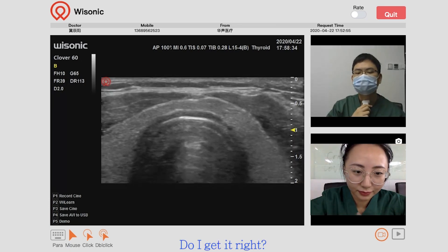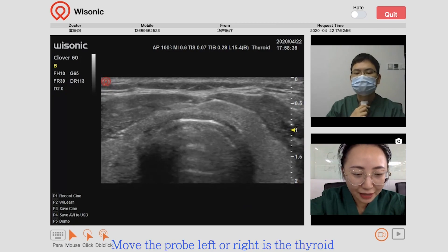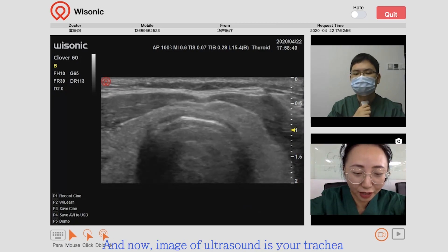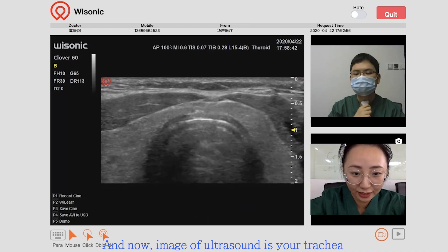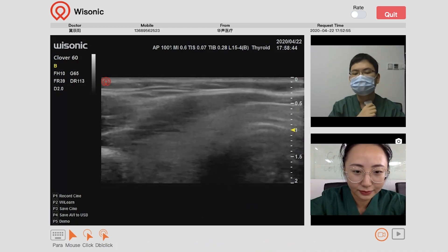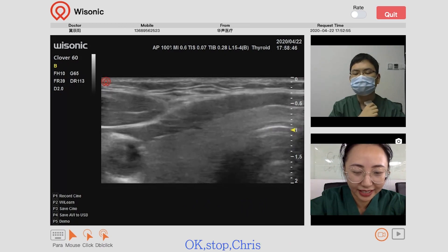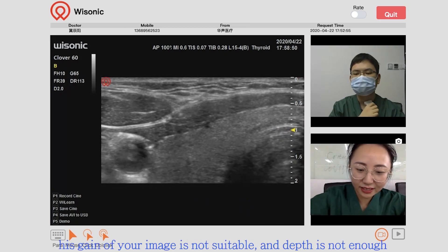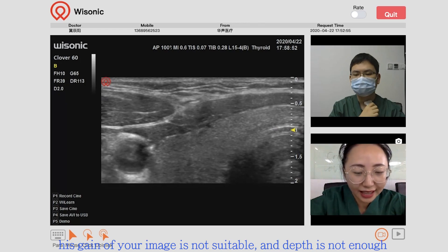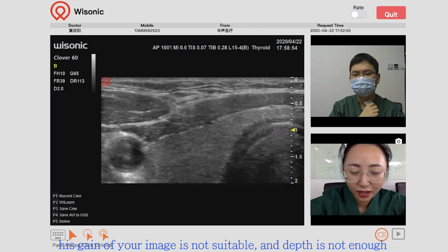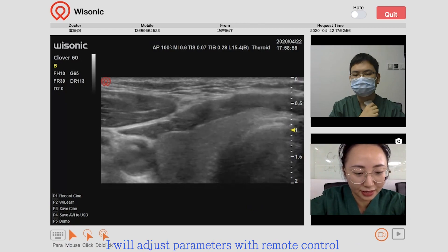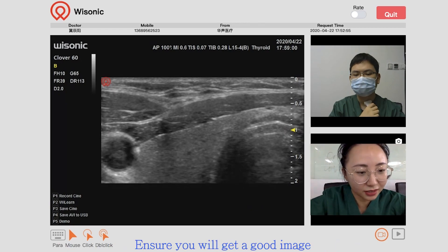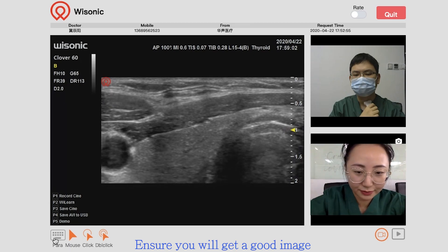Do I have it right? Move the probe left or right — that's the thyroid. The current ultrasound image is showing the trachea. Okay, stop. The gain of the image is not suitable and the depth is not enough. I will adjust the parameters with remote control to ensure you get a good image.